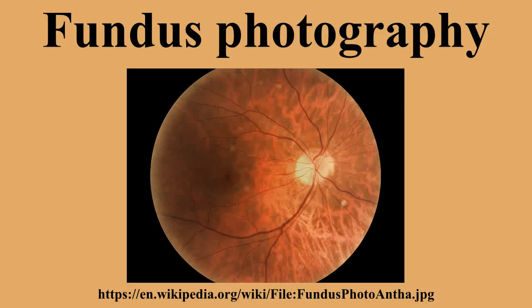The patient's records ought to contain documented outcomes of the fundus photography as well as a depiction of variations from previous photographs. They should contain an interpretation of those results and the relevant changes it could have on the treatment plan. Fundus photographs without an interpretation are seen as obsolete. The records should be legible and contain suitable patient information and clinician details.